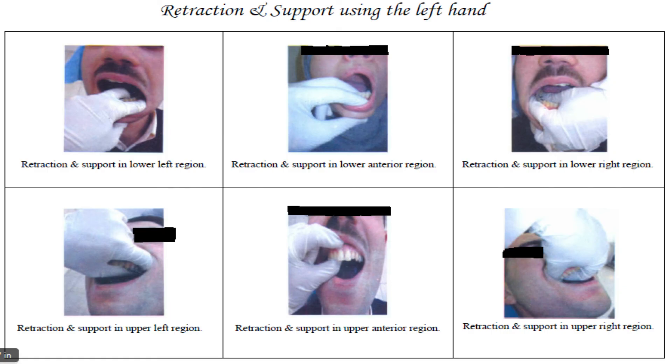Retraction and support in the upper left region: by the thumb and index fingers, with the three other fingers positioned to avoid injuring the patient's eyes. Retraction and support in the upper anterior region: by the thumb and index fingers, the same as the previous. Retraction and support in the upper right region: by the thumb and index fingers.